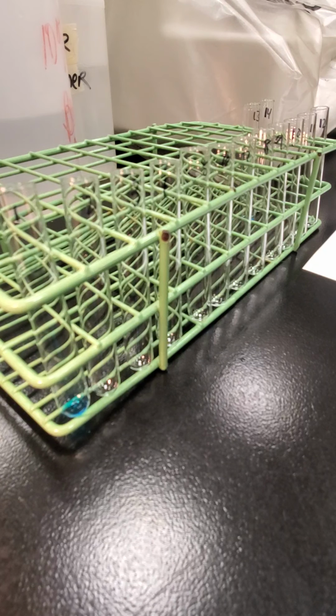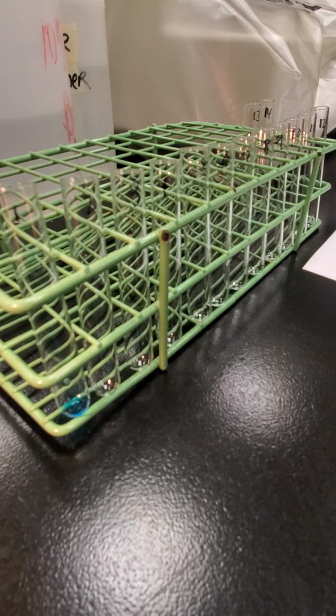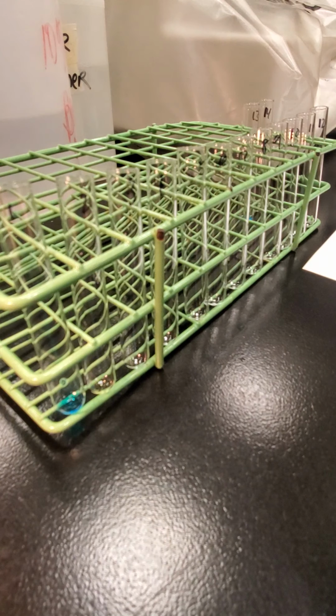Okay, so then I'm going to add anti-B to tube 2. And to tube 3, A comma B. So this has both anti-A and anti-B in it. And then to tube 4, I'm going to add 1 drop of saline. That's going to be our ABO control.